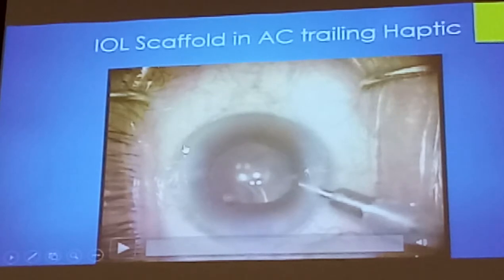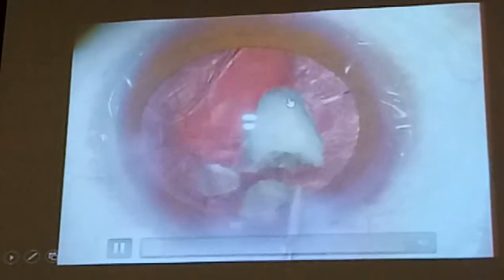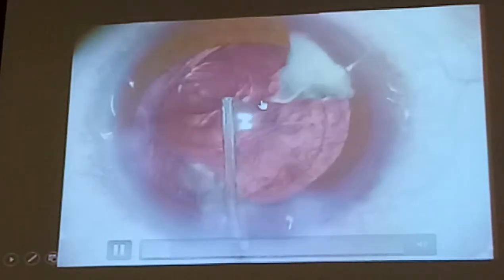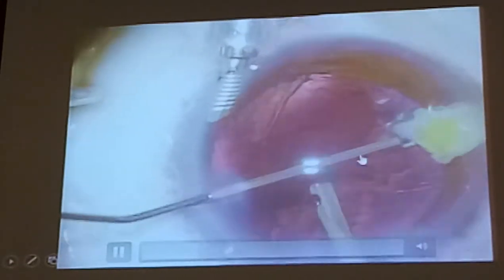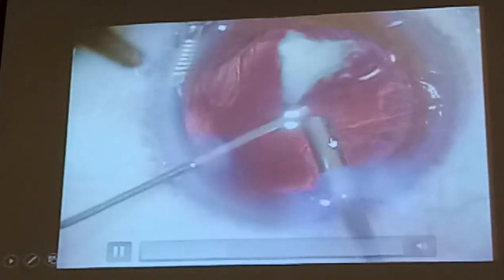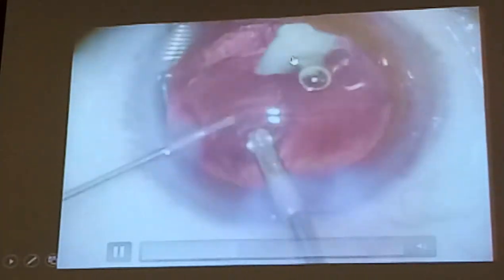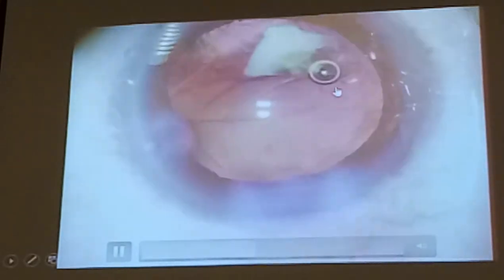This is my trainee doing a case. Of course, it's the last fragment — a PCR has occurred right there. This fragment is stuck to the vitreous. So this goes in last to push back the vitreous. As I said, today I will not go through the main incision — I will create a side port here. This is being trapped in the OVD. I don't want to remove the OVD because it will start to mobilize my nucleus. So I told the nucleus to stay there. Now I'm in IA mode — I'm keeping guard on this nuclear fragment. You can clean up all the cortex; this is important so you don't have persistent inflammation.